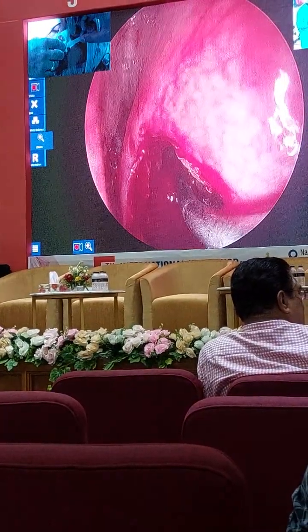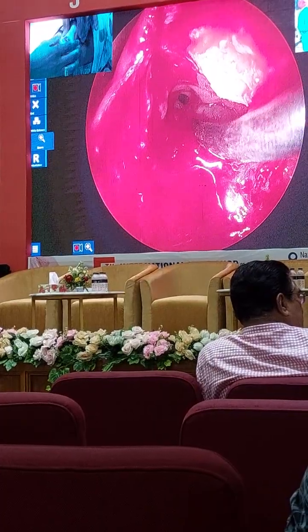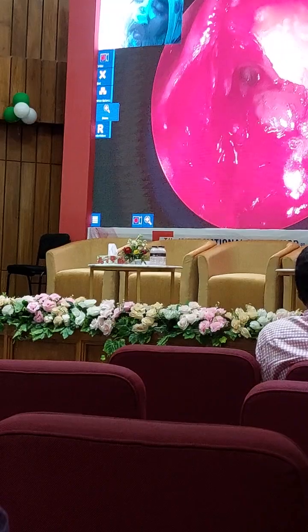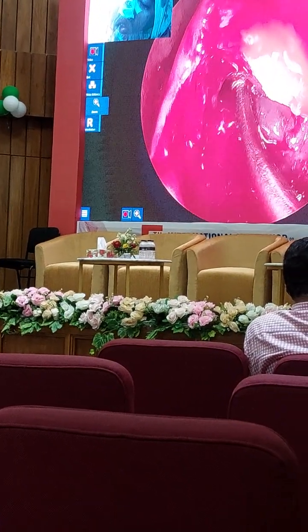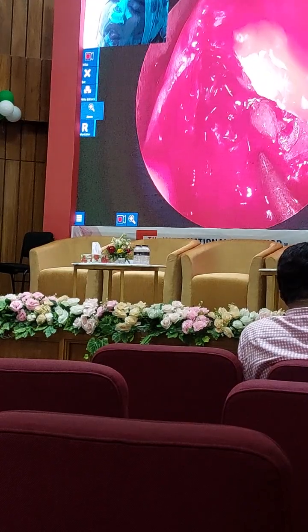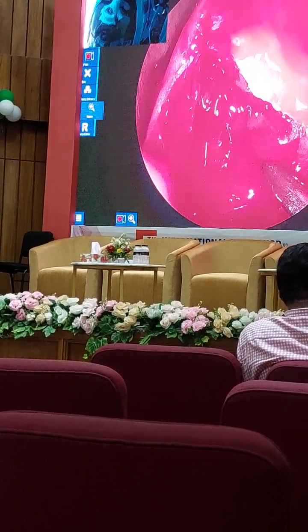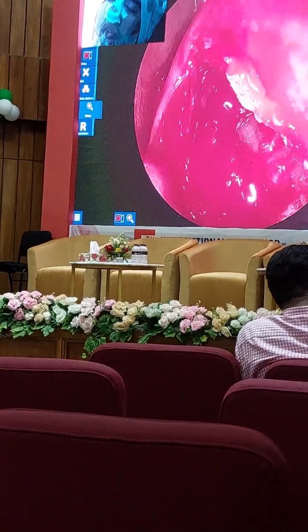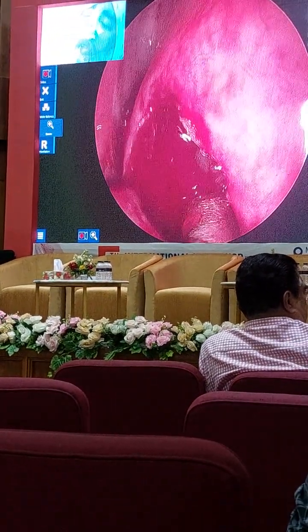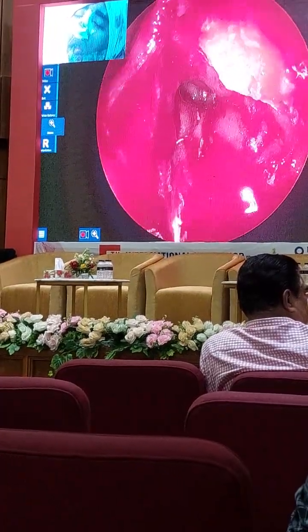Okay, so now you see my seeker is in the frontal. It is not anything great, it is just understanding your CT scan and using the right instruments. And then from there I can just fracture laterally to widen it. I don't want to go medially where there is the cribriform plate. My two safest places are laterally and anteriorly.